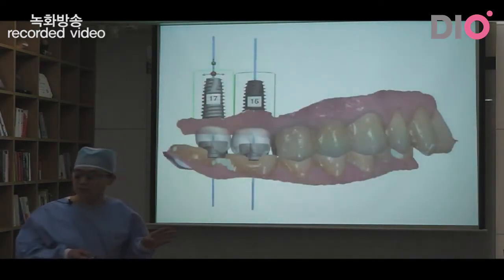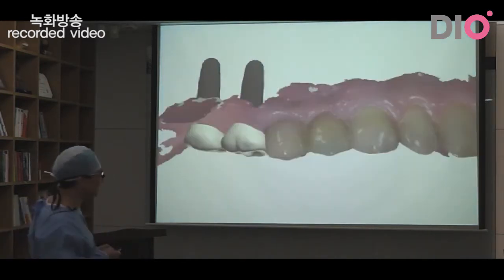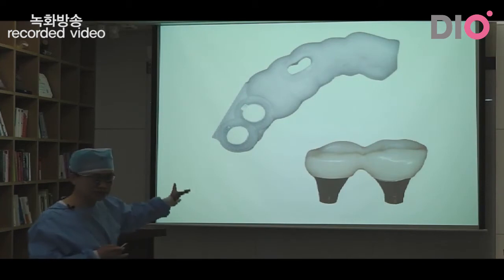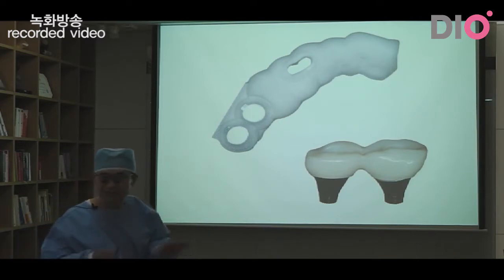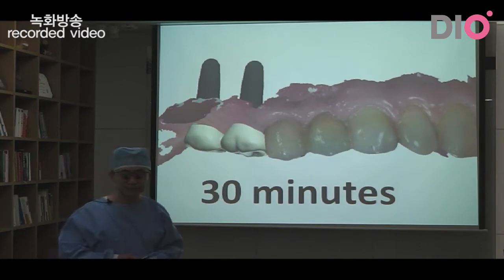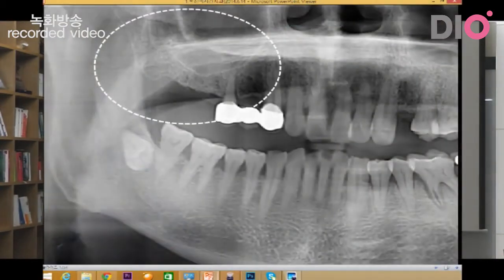On the merged image, I did implant planning on the digital image. And then I designed abutments. I designed crowns. I designed the surgical guide. You can see here the surgical guide, the crowns, and abutments. They are ready. They are prepared in advance before surgery. What I am going to do today is to make teeth in the area in 30 minutes. Now I'm ready. I'm moving to the OP theater, and then I will start the procedure.